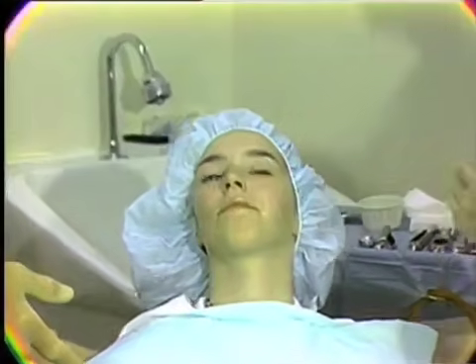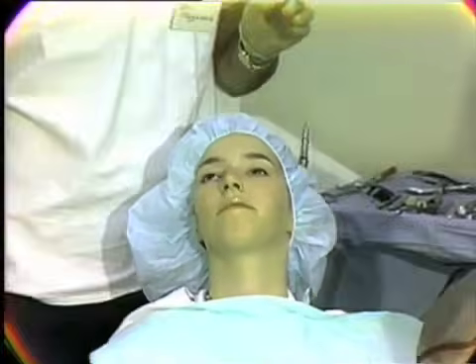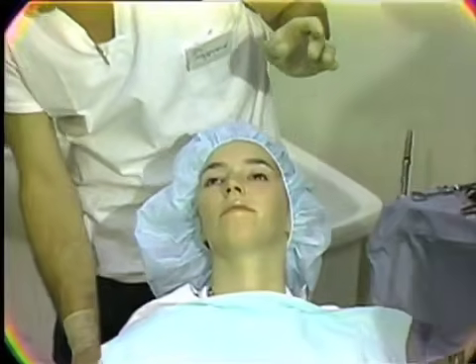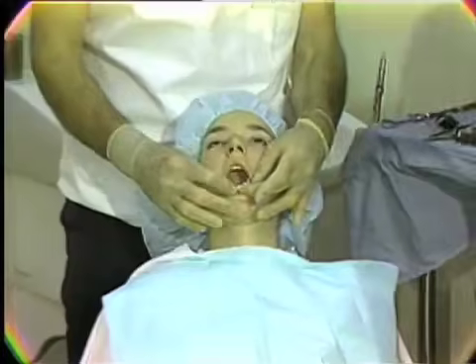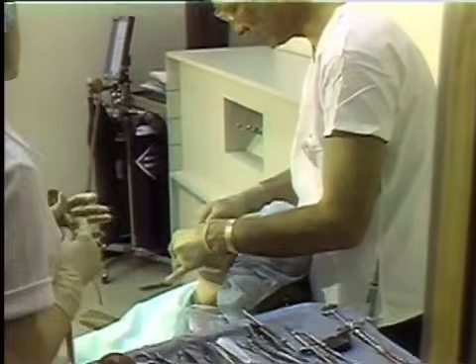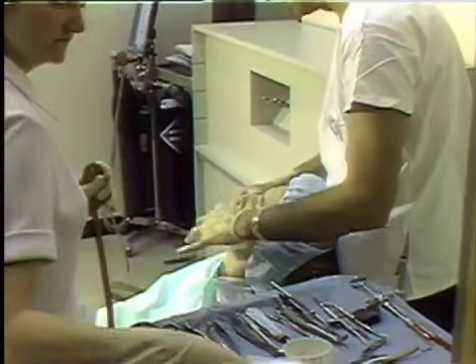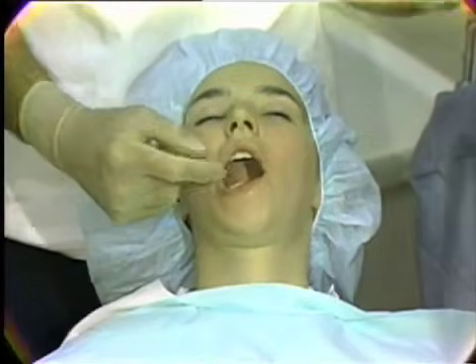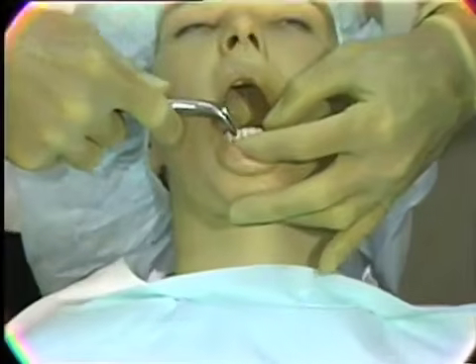In that instance, the patient is lowered, the operator gets behind the patient, and the chair is tipped back slightly, so that when she then opens, the operator has, once again, the advantage of direct vision of this particular field and can manipulate, again, with forceps or other instruments quite readily from this posture.